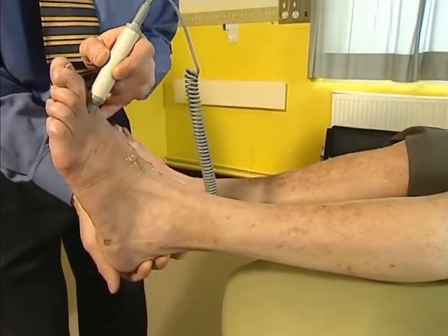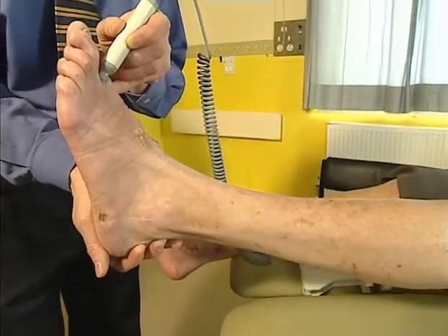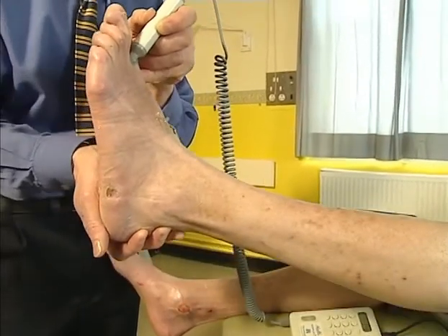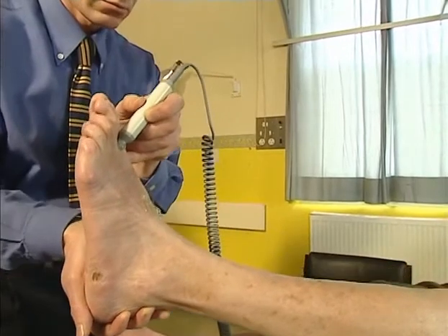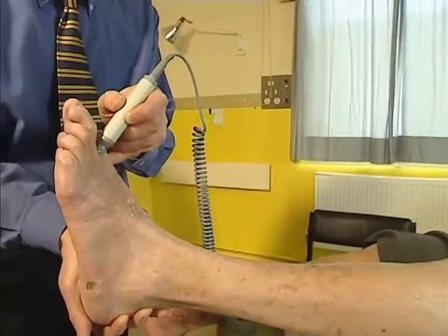Another test that we'd like to show you is the pole test. We use this to determine whether a patient has poor blood flow in the presence of arterial calcification, and it is useful when toe pressures cannot be measured.